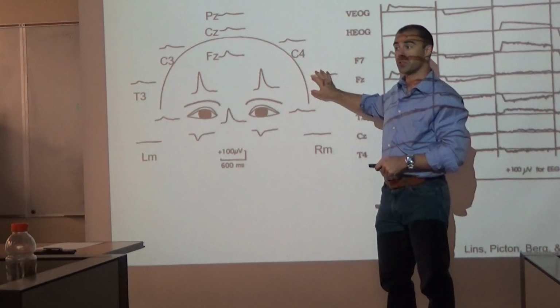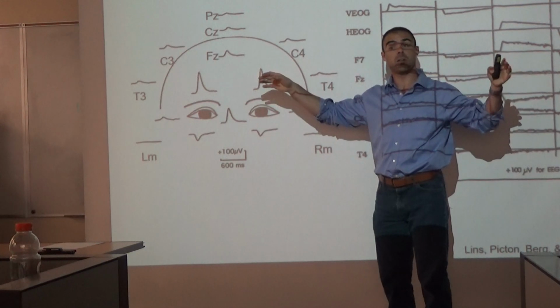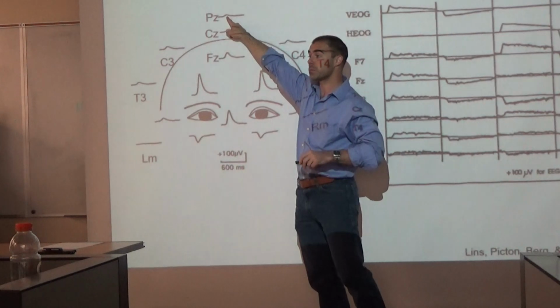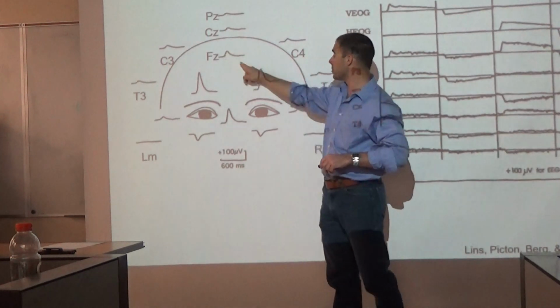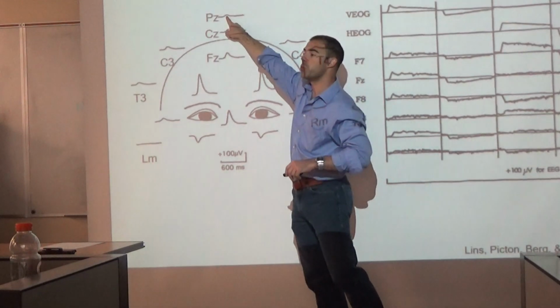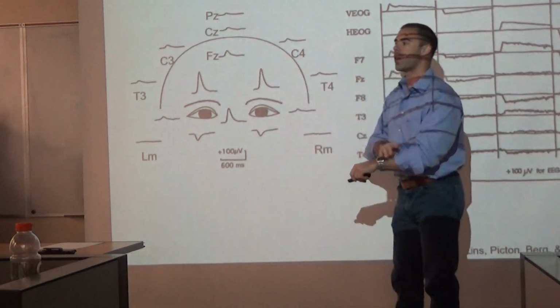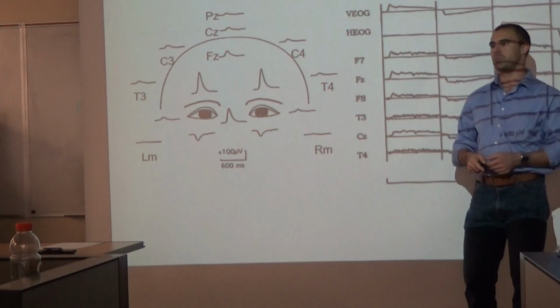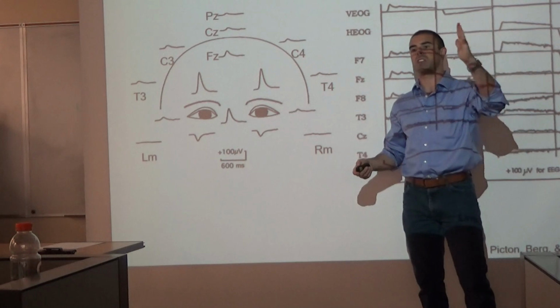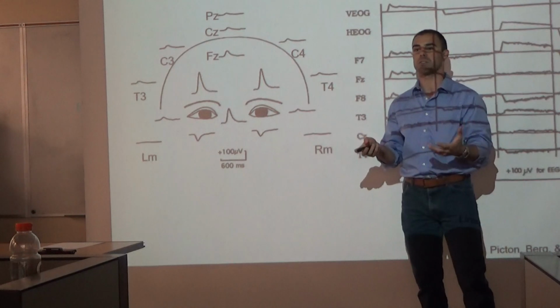One of the things that this figure is really nice in showing is that whereas it does spread to our other sites on the head, notice how the further away you get, the smaller the effect is that spreads. You guys notice that? When you're really close, that's a bigger bump. The bump gets a little smaller and even smaller when you go to the posterior sites and the central sites. A lot of that is because there's a decay function, which is basically the rate at which the electrical activity will decay as it spreads through human scalp tissue, and it is a relatively constant function.